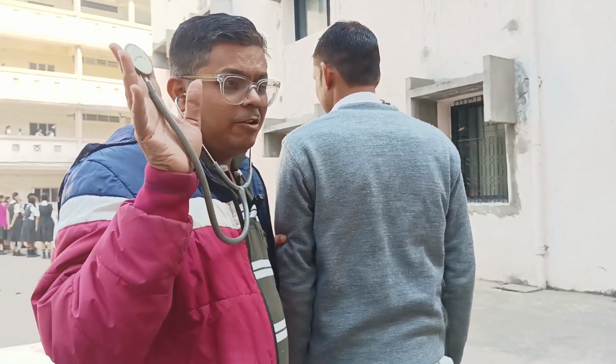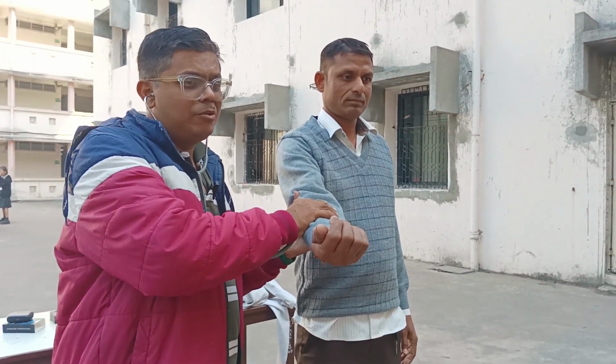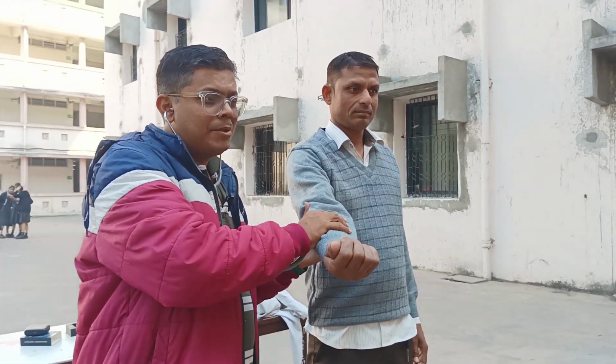And it is the mechanical way. It needs what? A medium. Okay. Here also you can know how the heartbeat is. Okay.